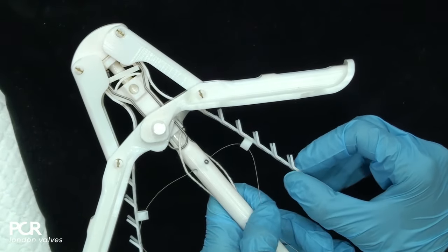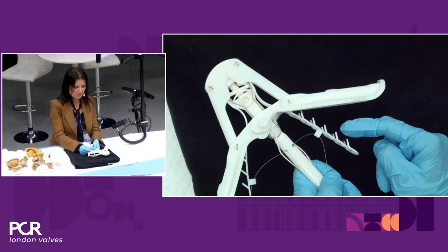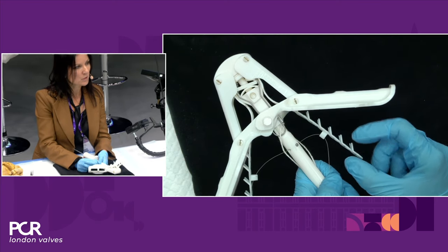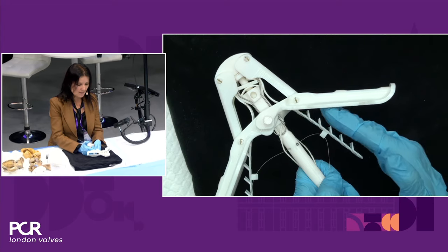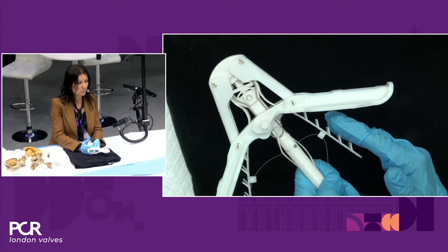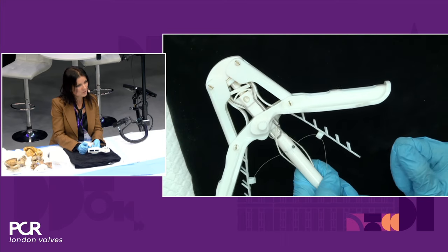Another key design element with the gripper is the length of the frictional elements. The length of them is determined by the thickness of the tissue. So we ensured that those frictional elements are shorter than the thickness of the tissue, and that makes the gripper not penetrate the tissue, not damage the tissue. It acts like Velcro to gently secure the tissue inside the clip.